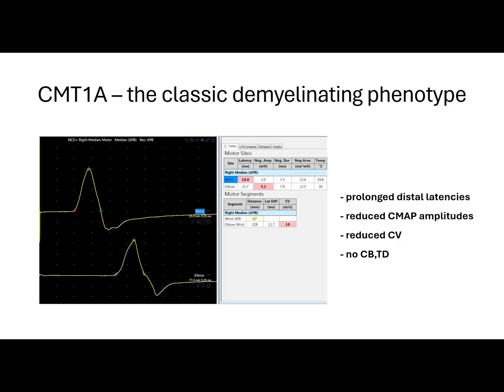This is one example of the classic demyelinating phenotype, CMT1A, where we can see a right median motor nerve conduction study recorded from the APB muscle with prolonged distal latencies — at 10 milliseconds — reduced amplitudes at 3.9 millivolts, and reduced conduction velocities at 19 meters per second. There is no evidence of conduction block or temporal dispersion.